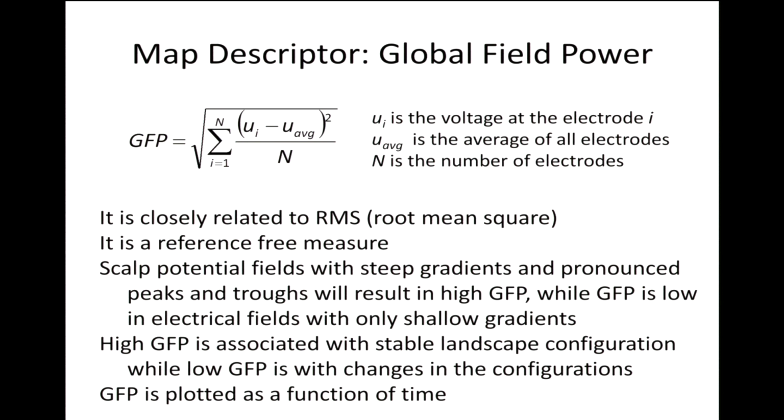Different electrodes are doing slightly different things, because it's a spatial standard deviation. You are checking how much the potentials vary over all your electrodes. If some focal activity on some channel shows a strong ERP peak and other channels do not, then you get a high standard deviation. That is the idea.